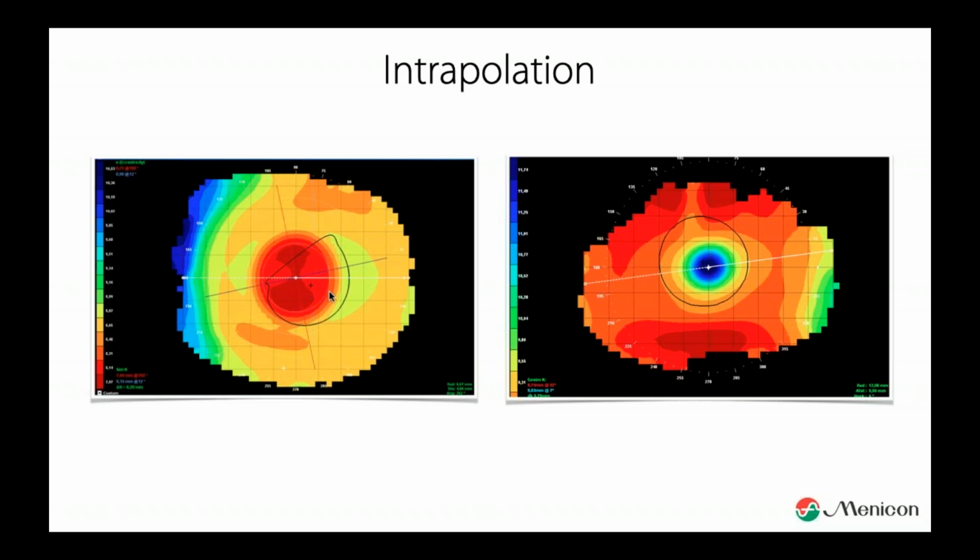If you see a perfect red spot or a perfect blue spot, that's strange. It screams to you, okay, this is something you cannot rely on. You have to do it over. So again, complete darkness, then you will prevent that as much as possible. It will still happen to you, but be aware of that.